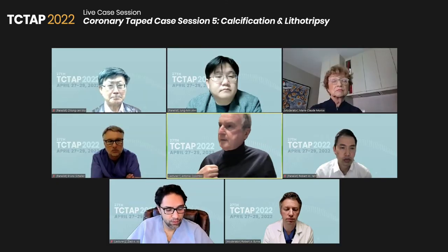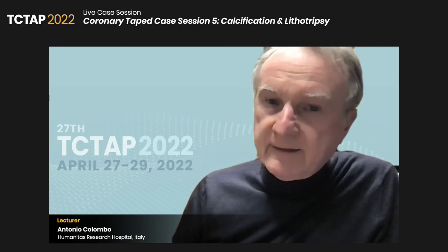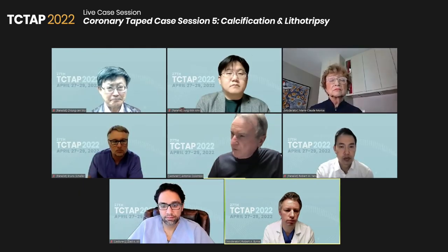But first of all, let me congratulate Ziad for his description of the nodular calcium. I learned something today, and it's really very important. Nodular calcium is not nodular calcium; there are types of nodular calcium. This is a very important element to keep in mind. To answer your question, we use IVUS or OCT, more IVUS because of expense, and decide where to concentrate the action of the shockwave. So we base our strategy according to the extension of the calcium at the time you do the shockwave. Almost always we do IVUS when we do shockwave, before and after.